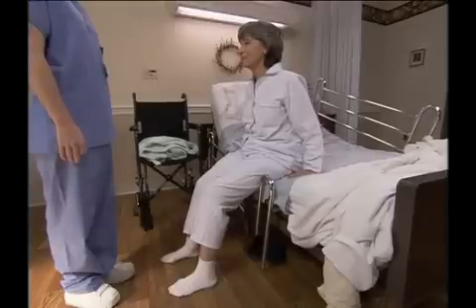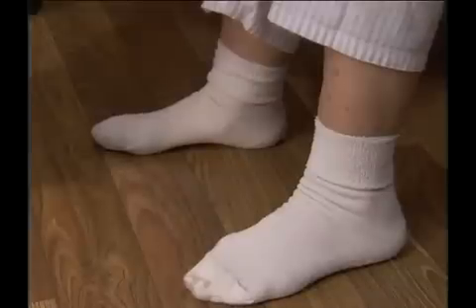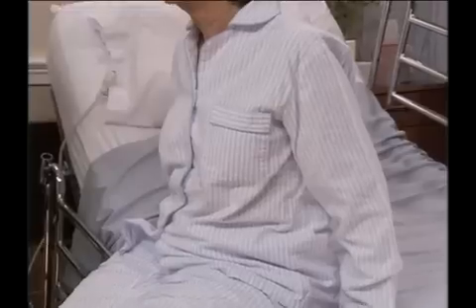This helps equalize blood flow after a person has been lying flat for a long period of time. Make sure the person is sitting squarely on both buttocks with her knees apart and both feet flat on the floor. The person's arms should rest alongside her thighs. A note of caution: if the person is rushed through this step or not allowed to rest at all, she may become dizzy and fall while attempting to stand, so allow her to sit for several minutes before proceeding.